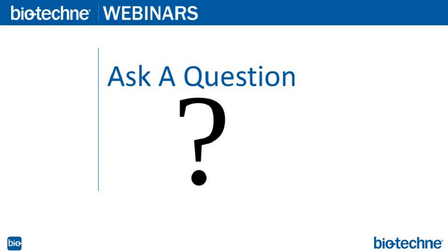Well, this is a good question. At least for the GI tract, the regional stem cells are all grown in the same medium and differentiated in the same medium. We highly recommend you seed enough immature stem cells in your transwell. Normally it takes 5 days before you can see the structures, and about 10 days to fully differentiate. Then you can observe all the appropriate cell types in that particular region of the GI tract. Among all the GI tract stem cells, we observe a similar time needed for differentiation, and we haven't seen a big difference between the cells in the GI tract. It takes about 10 days after the air-liquid interface is formed.